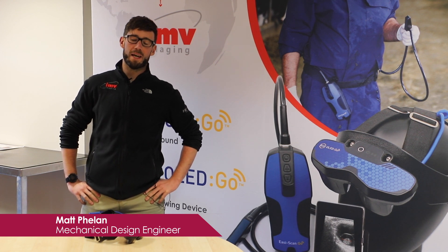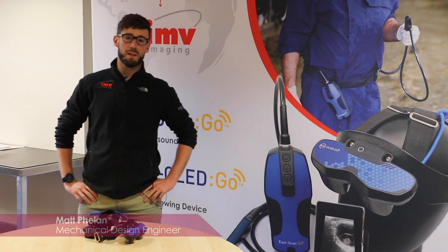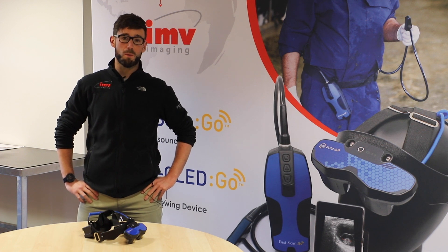Hi there, my name is Matt Phelan. I'm a mechanical design engineer at IMV Imaging and I'm here today to show you how to fit your wireless bugs.